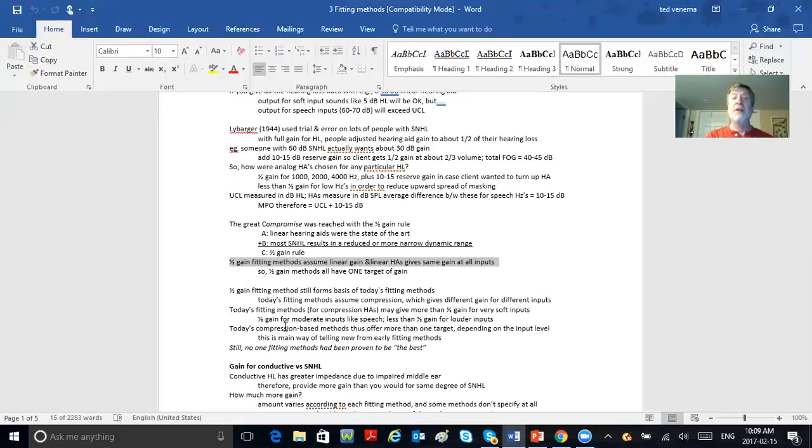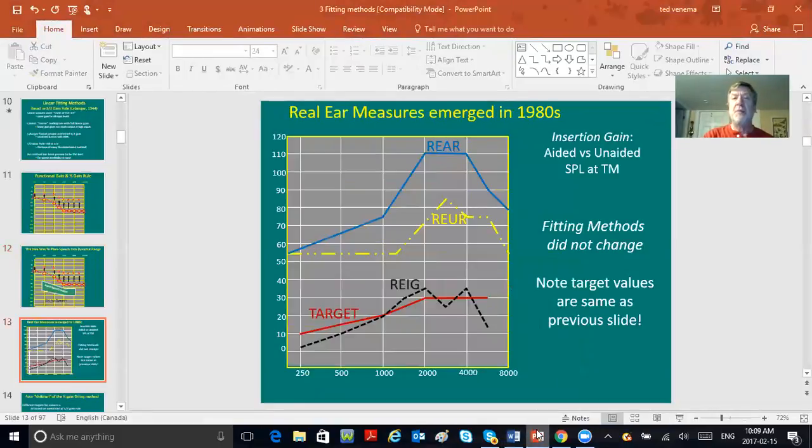And we no longer even use this kind of real ear anymore. We don't even use that. We've jettisoned it. About 10 years ago, that was thrown out the back window, okay? Today, we use speech mapping, which is, as they'd say down in the deep south, mo better.